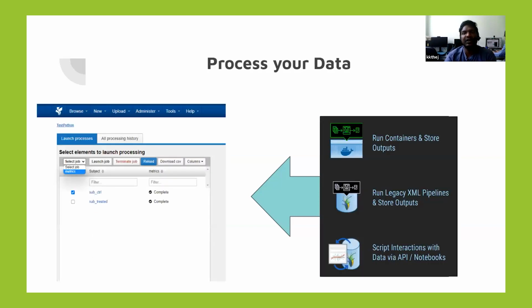Talking about processing your data, we have great features on XNAT, which uses containers to process your data. You can create a container, and in this screenshot we have a list of jobs that you can do on the data that you have.